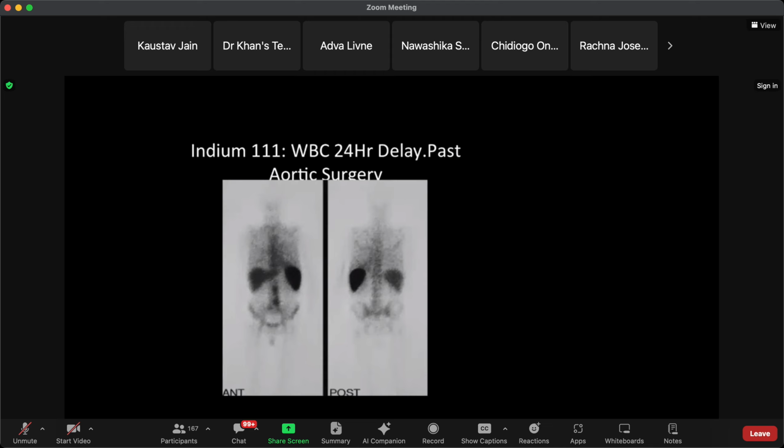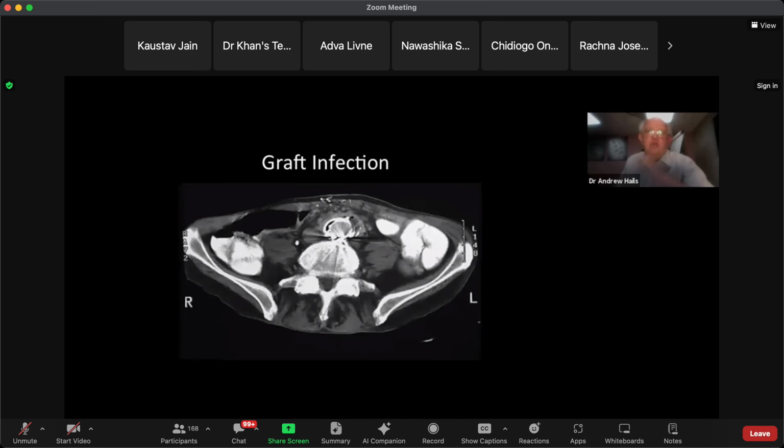In a patient with recent aortic surgery, this might suggest an aortitis or infection around the surgical site, and I would review and correlate with some cross-section imaging to identify this. Yeah, you must have the cross-section imaging, which there it is. The patient actually had a graft and there was an infection around with a little bit of gas in, as you can see.